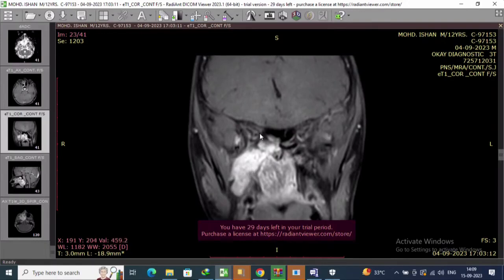What we'll do, at the edge of the lateral wall of the nose here, after catching the vessel, is divide the tumor here. Planned division. We'll divide and remove the medial part first. We'll acquire space in the nasal cavity and then mobilize the lateral part into it. That's how we are going to remove it.